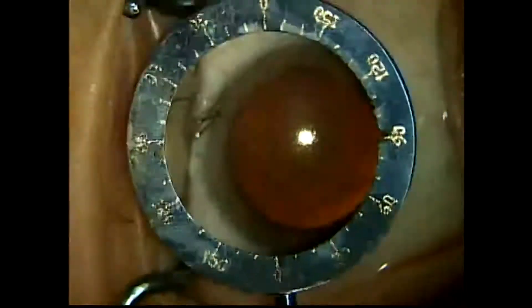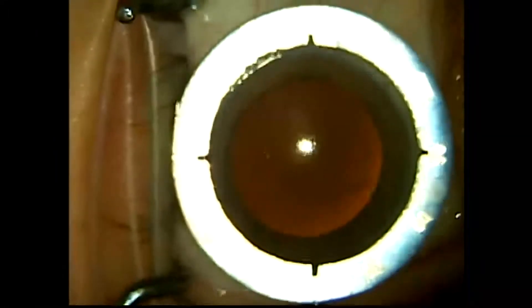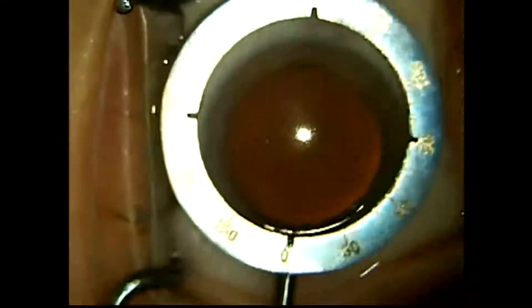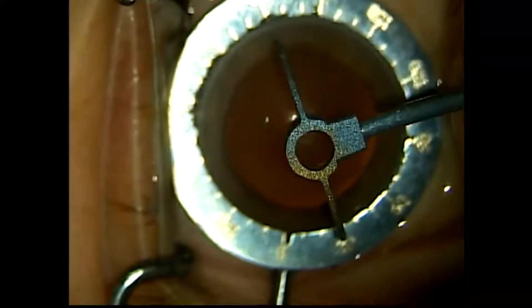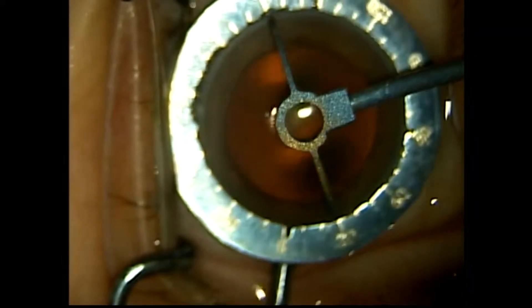We go ahead and correct her astigmatism first. We have already pre-marked the eye at 3 and 9 o'clock while the patient was sitting upright. Then we laid them down, prepped and draped them. Now we are lining up our axis marker at 3 and 9 o'clock and we make a mark at the 30-degree axis.